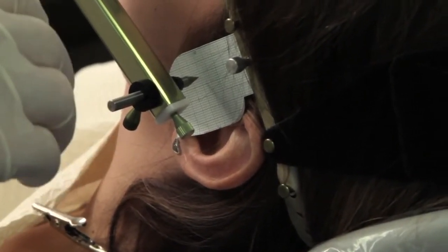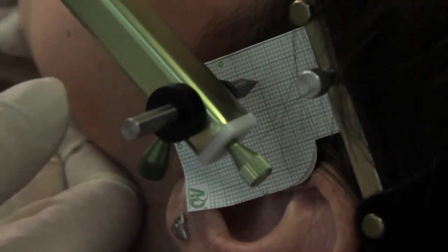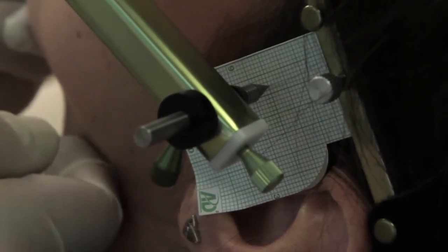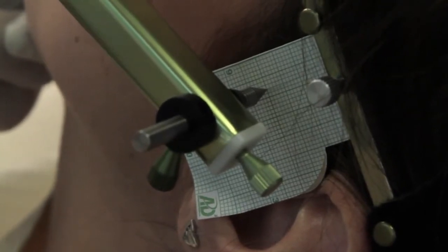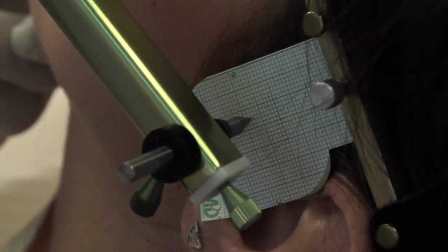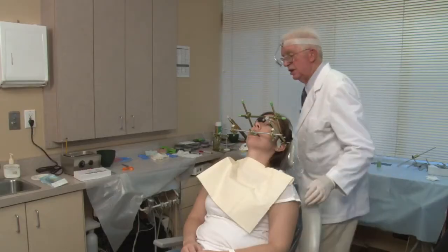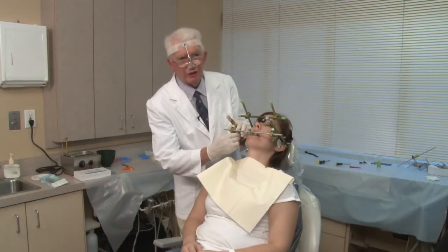And depending on if the hinge axis point is above my stylus pen, then the stylus pen will make an arc like this, and I know then that I got to move the stylus pen up to get to the center of that circle. And you'll be surprised as to how far you move the stylus pen to locate the axis. I like to move it way too far the first time and actually go past the hinge axis point and then come back to it. Usually on a stabilized case, you can find the hinge axis in 3 movements, 4 at the very most.